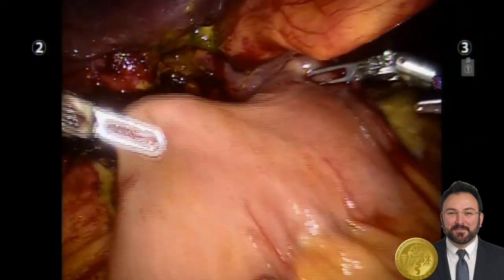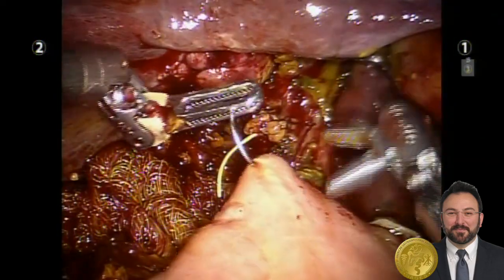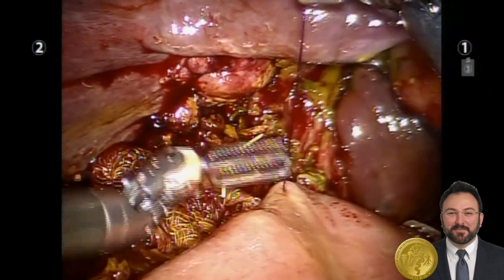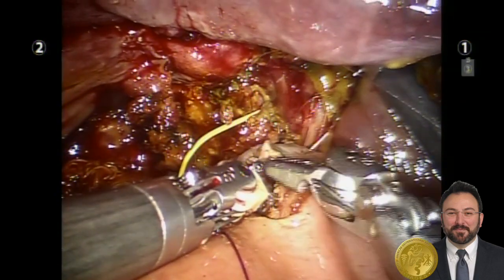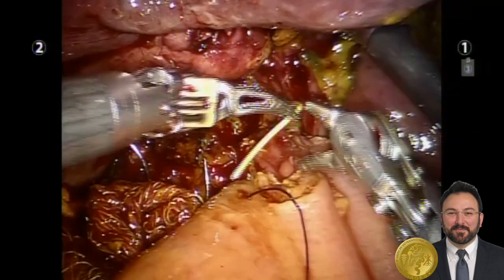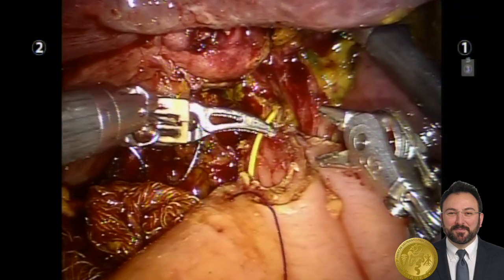That limb was then brought up to the injuries, and the posterior row was performed with a running spiral knotless 3-0 suture. The left biliary system was then anastomosed with absorbable 5-0 suture, and that repair was cannulated with the PTHC catheter.